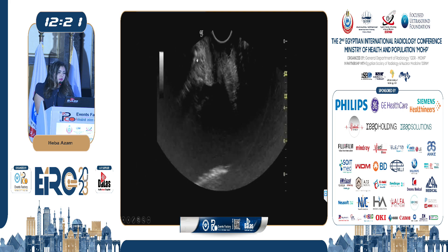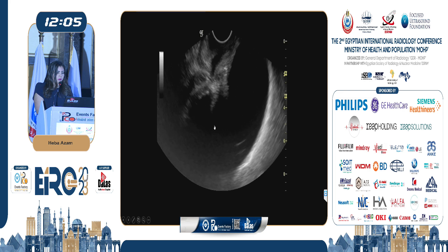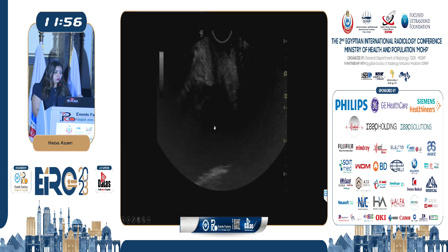Here, this is the symphysis pubis. Please concentrate on the movement of the urethra and bladder in relation to the symphysis pubis and the direction of movement of the urethra. As you can see, there is marked descent of the bladder with a total change of urethral direction from vertical to horizontal.